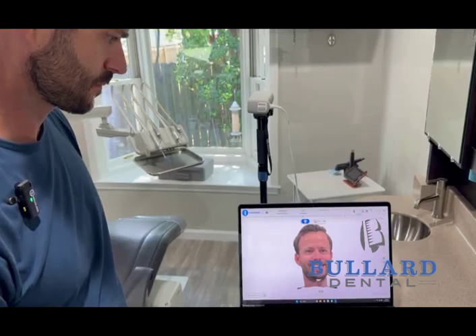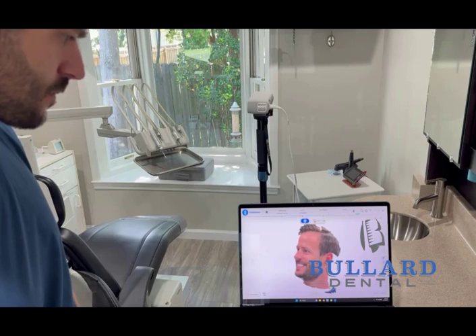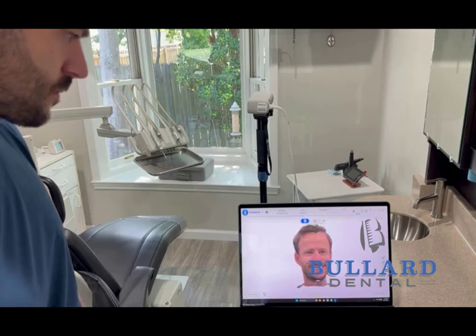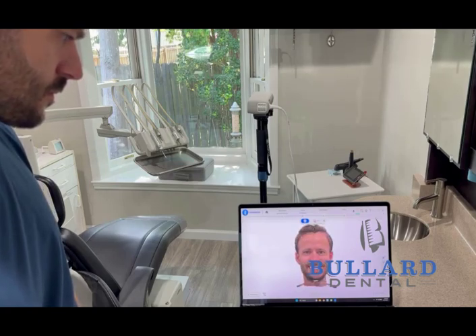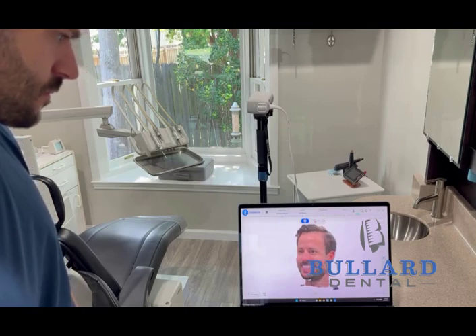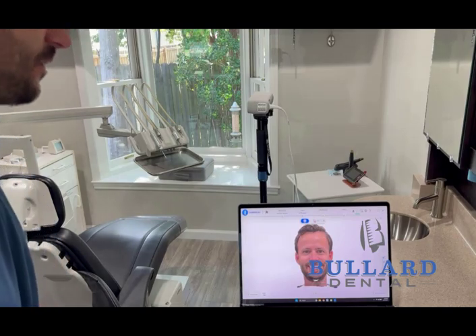You can see the preview available. For us it's very important to have the ears really well captured, the eyes looking straight forward, and of course the teeth very detailed. We'll pull it into ExoCAD and show you the wireframe.